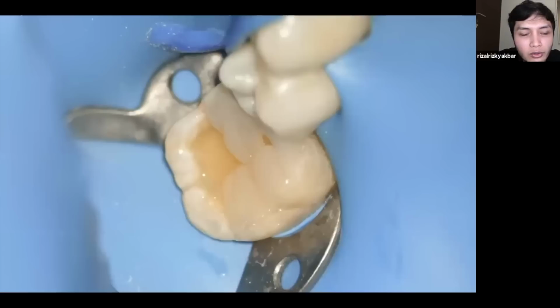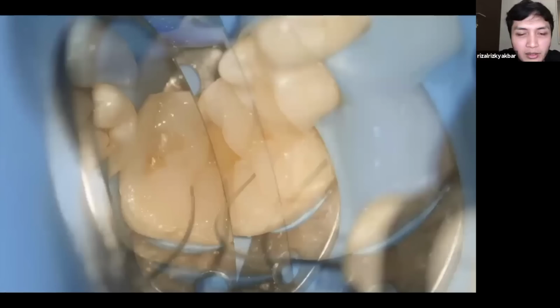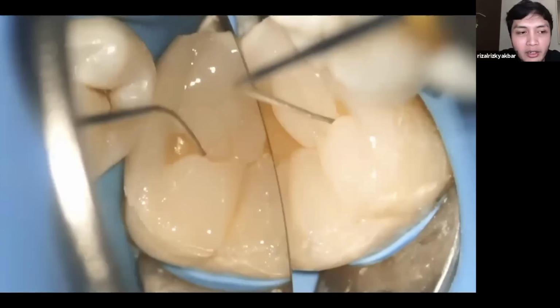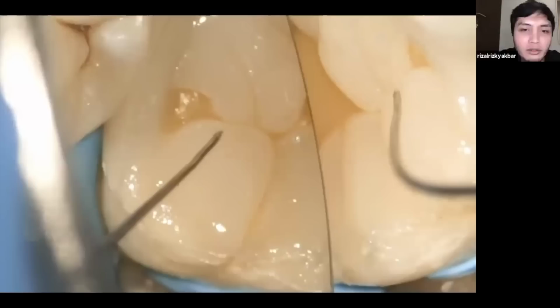So I like to use a brush as well. Brush, I think, is really recommended, especially to make the composites well adapted. I use the Tokuyama brush. I think Tokuyama has a really good brush that you need to use in every composite case.